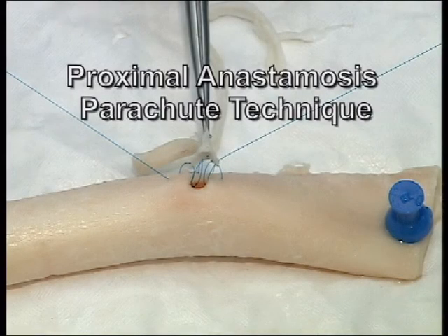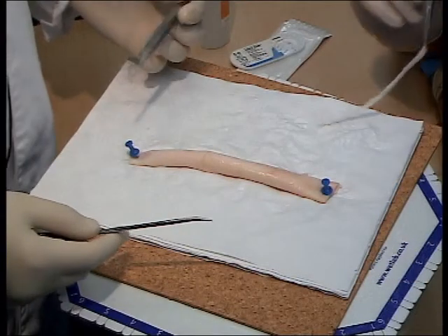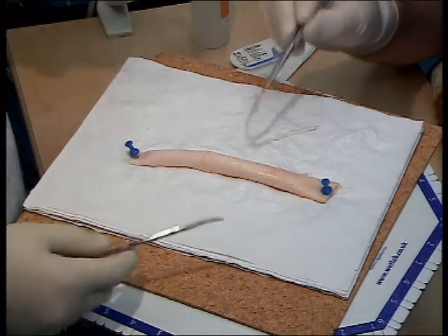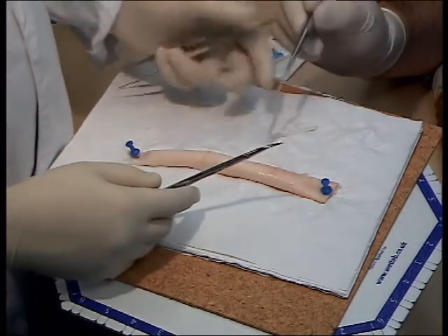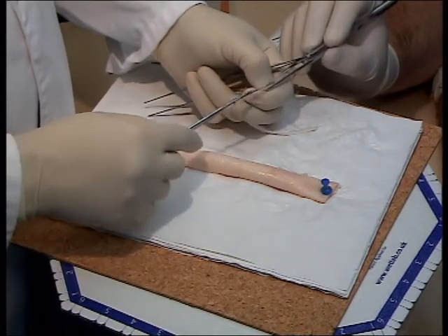Proximal anastomosis using a parachute technique. For this procedure, you will need a piece of descending aorta and a piece of ureter. The instrument list is described in your workbook.